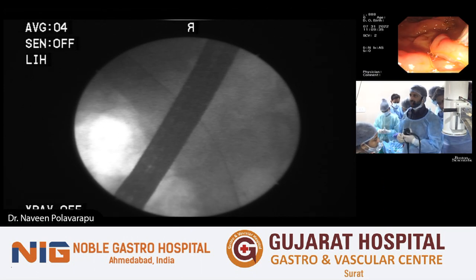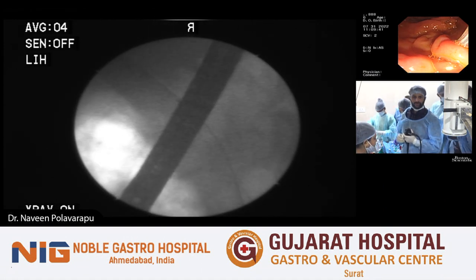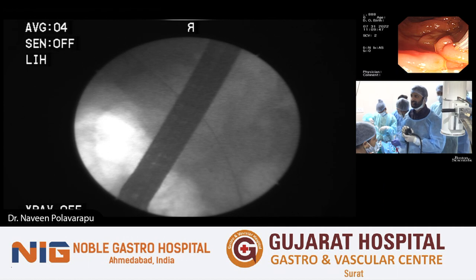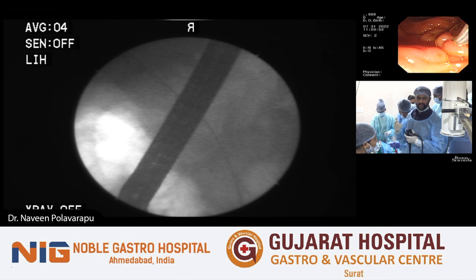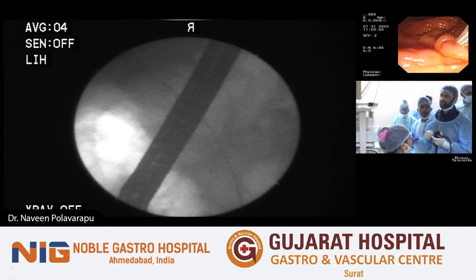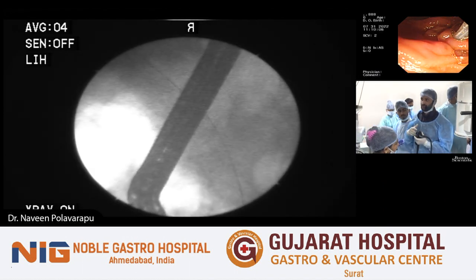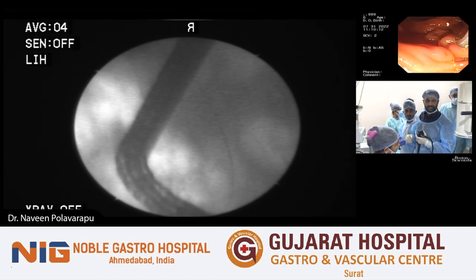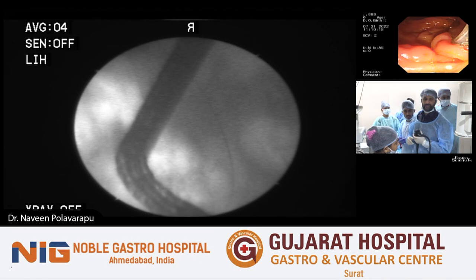Okay. So we just cannulated the bile duct and we got the wire in. I'm just trying to get a better view of the cholangiogram so that we know what we're dealing with. I tend not to put too much contrast because when we put in a cholangioscope, it becomes viscous and you will lose the views. So I tend to dilute the contrast. The whole idea of a cholangiogram is, first, to identify the duct size, what is the diameter of the duct, and where the stone is. Although we get information on the MR or other imaging, we need real-time imaging to understand exactly what is going on in terms of the duct size and the stone, because that decides what kind of therapy you want to do.